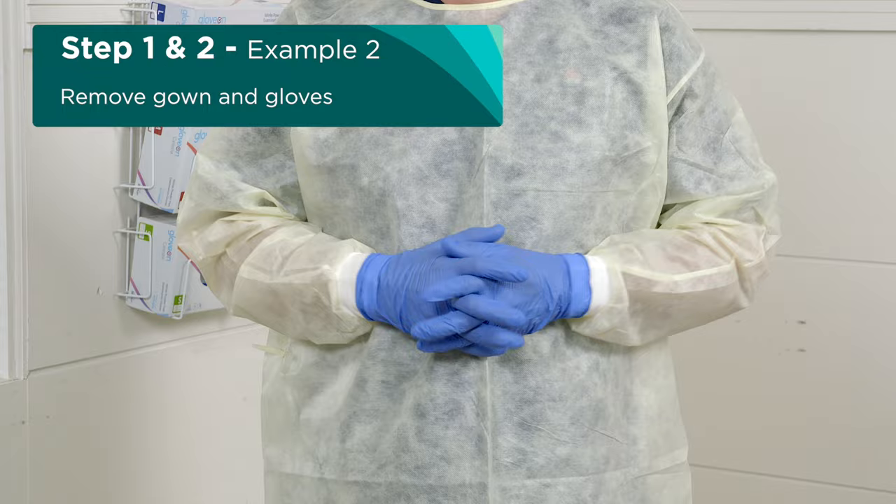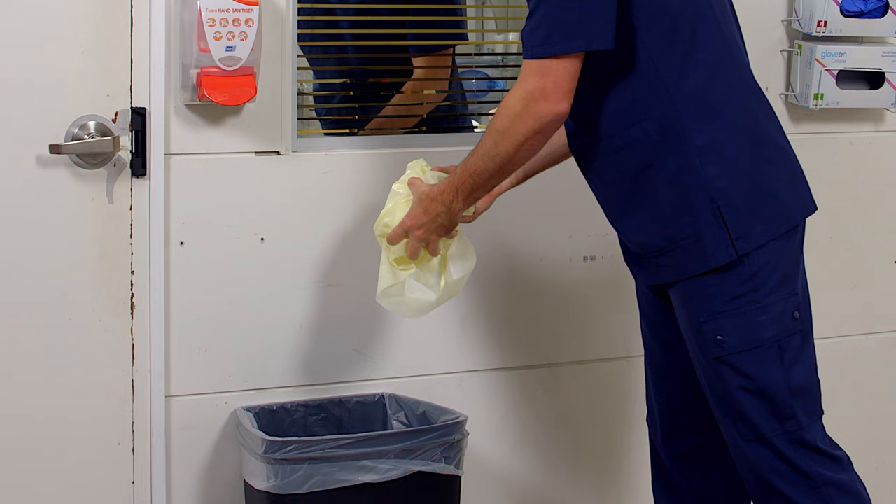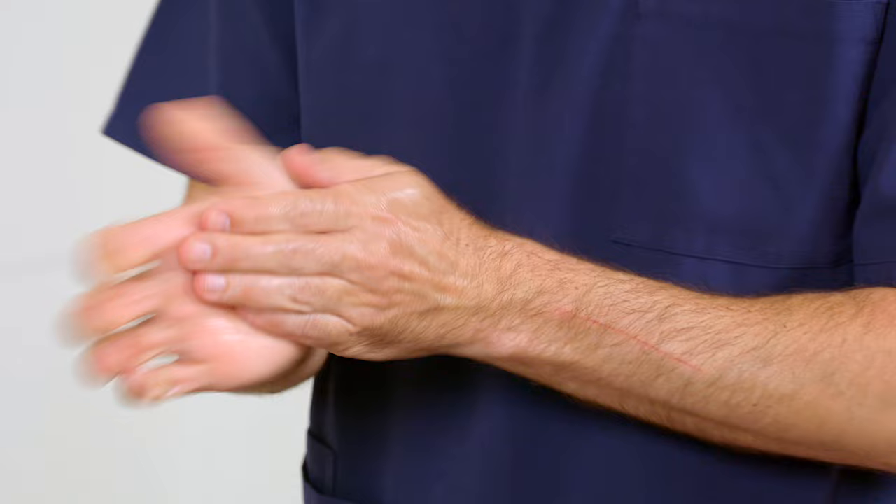Alternatively, with gloved hands, pull the gown from your chest and break the tie in a controlled motion, rolling the gown inwards and downwards, removing gloves along with the sleeves of the gown. Continue rolling and dispose of both gown and gloves together into the general waste bin. With either method, perform hand hygiene before the next step and after removing your gown to minimise contaminating your face.